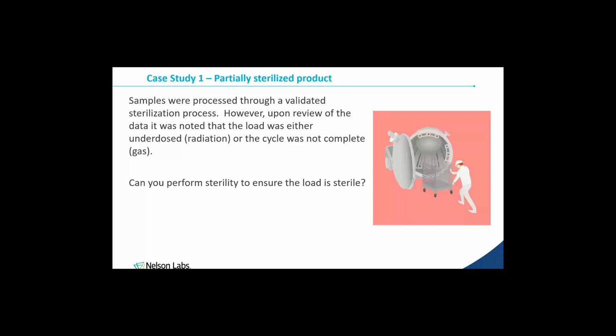So the second part of that is radiation. Well, fortunately, radiation dose is considered cumulative. So this is where your max dose validation is important. I want to be able to give myself some flexibility that if there's an issue with my load, then potentially I can go back and do what we refer to as topping off. So if there's an issue with the dose, I can send it to get more radiation dose.